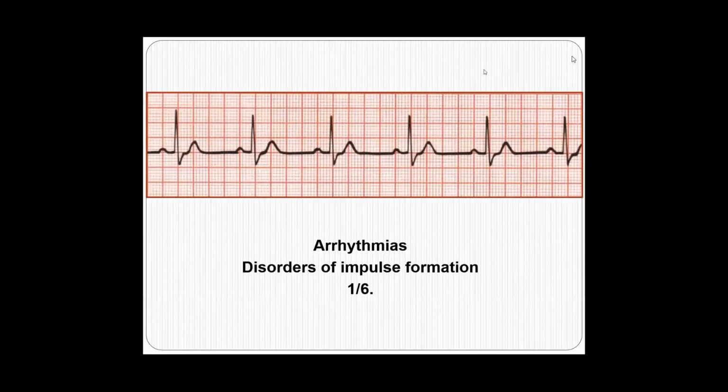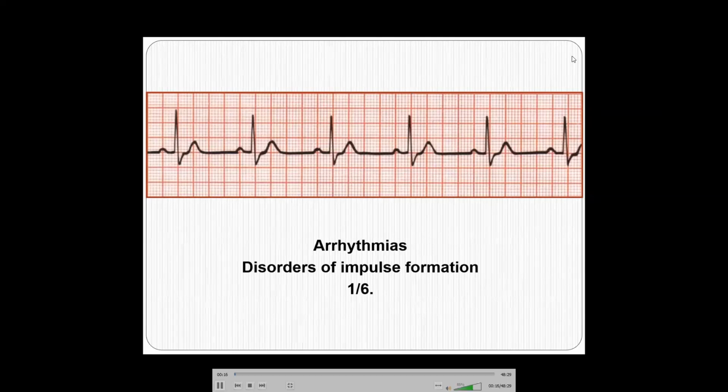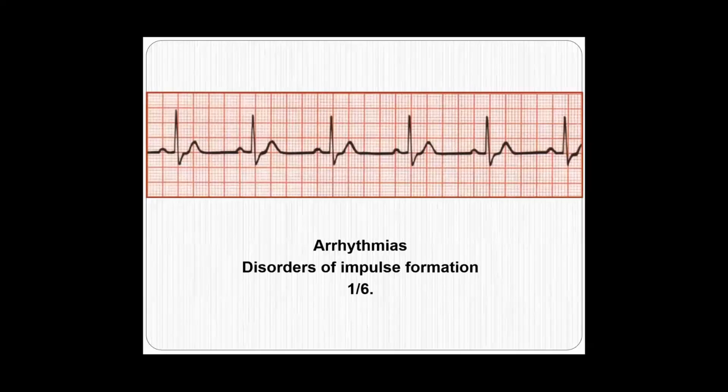So today we will start to talk about arrhythmias. Hopefully you watched all the movies about arrhythmias. That should be around six movies. It's a very important part of ECG because most of the use of the ECG is to diagnose arrhythmias, and this is the best tool to diagnose arrhythmias.